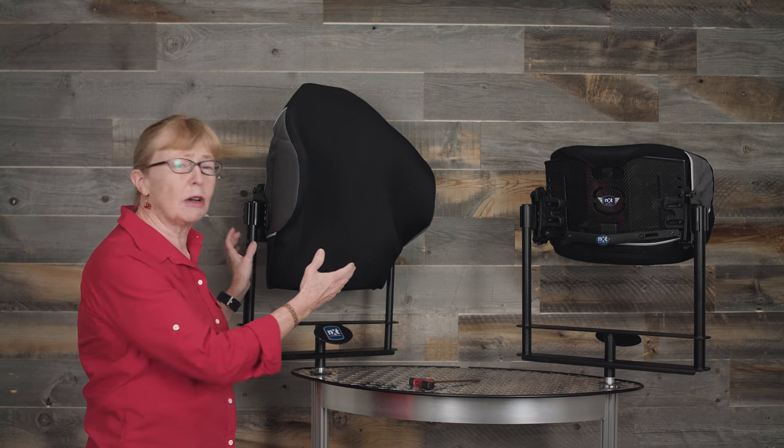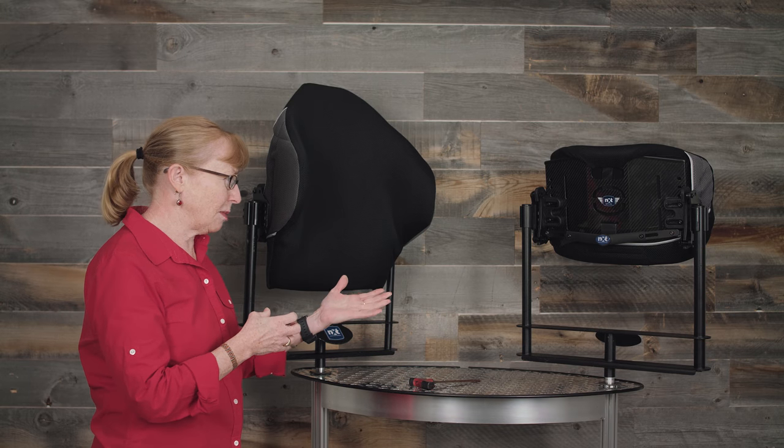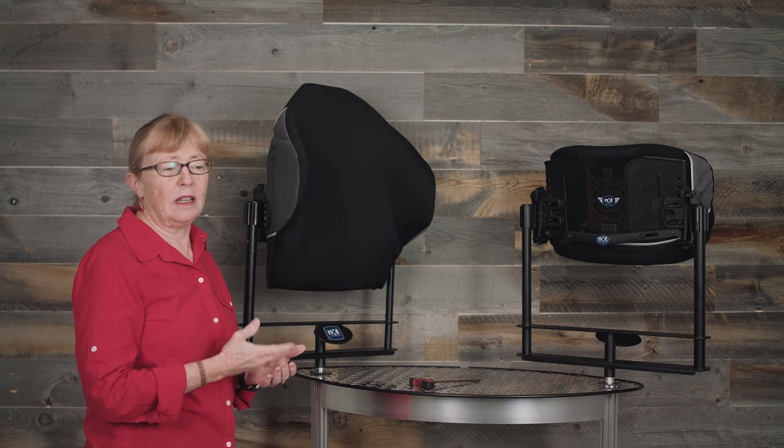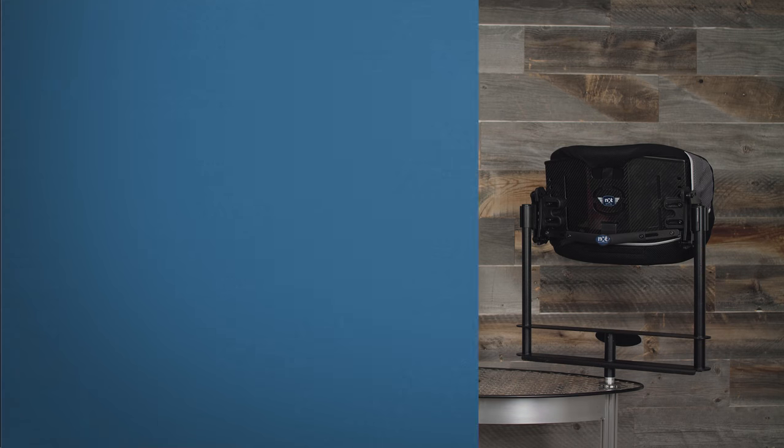Both the Optima and the Optima Carbon are identical with the exception that the Optima Carbon is made out of carbon fiber. Being carbon fiber, it is lightweight, it is flexible — the right amount of flex for a back support — as well as very strong.